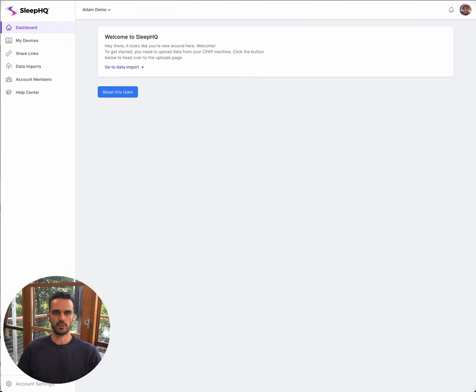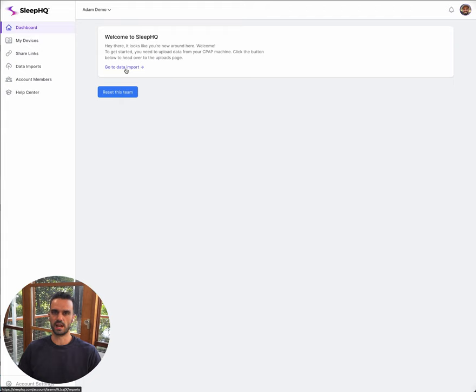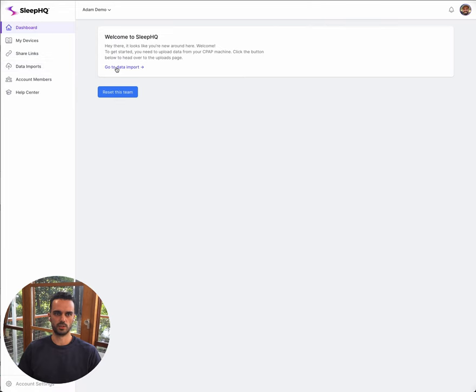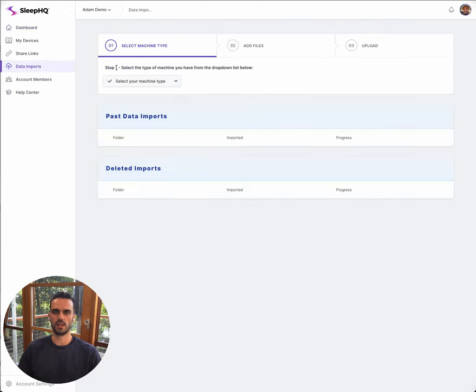So I've created a new account and logged into my Sleep HQ dashboard. The first thing it says is welcome to Sleep HQ and gives me a link to the data imports page. I can get to this anytime by clicking the data imports link in the menu, but this is just a little shortcut to get you there when you first sign up.